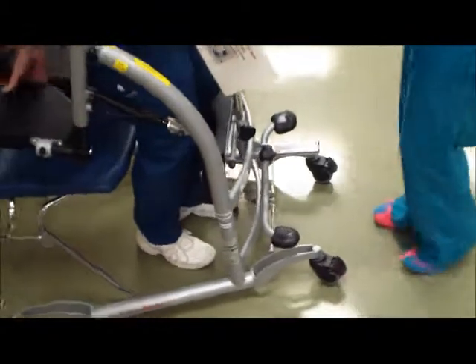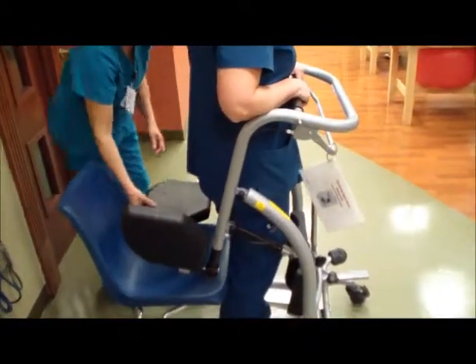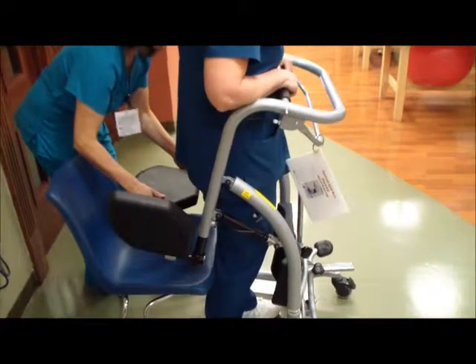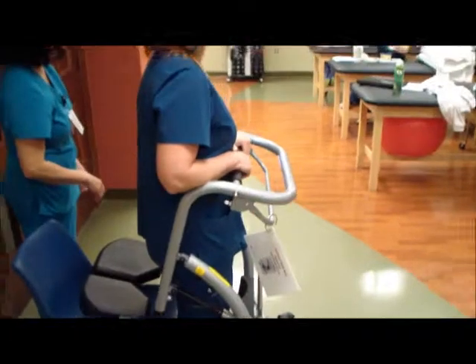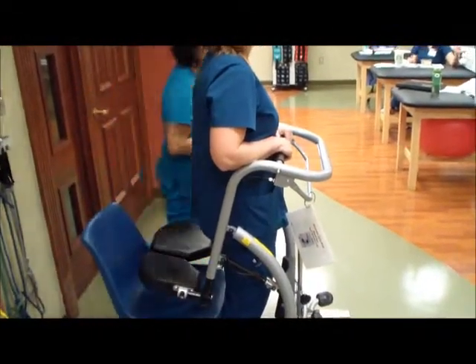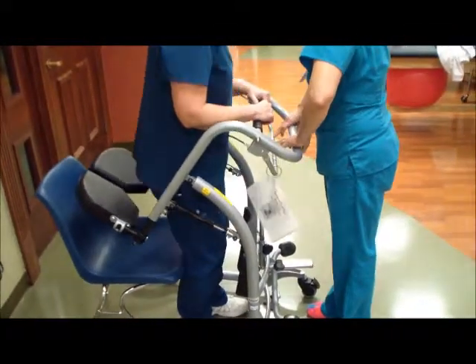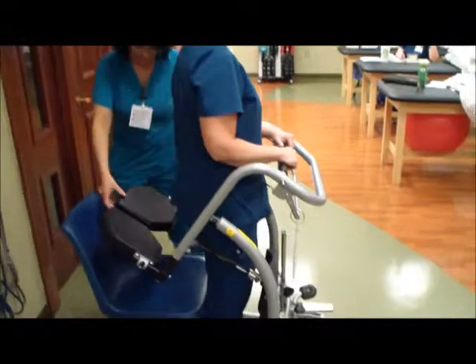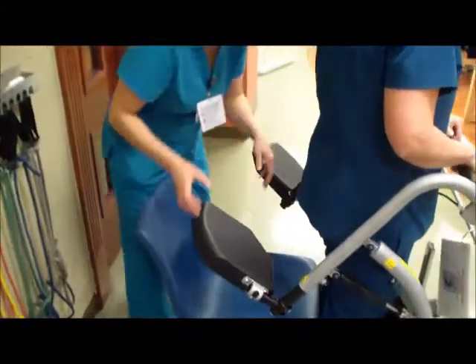Now, could you bring that bar forward before they sit down, or just move that stuff out of the way? Because you said you needed to load it for it to come down, but now can you push it the other way? I know you don't necessarily need to, I'm just wondering if it works this way. And then flip the little seats out of the way. You can push up and then move right out of the way.